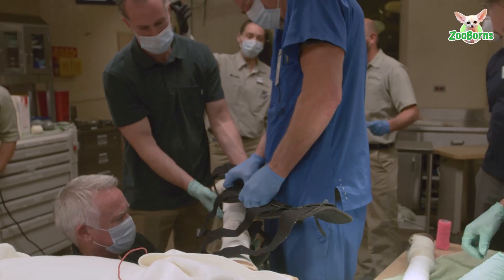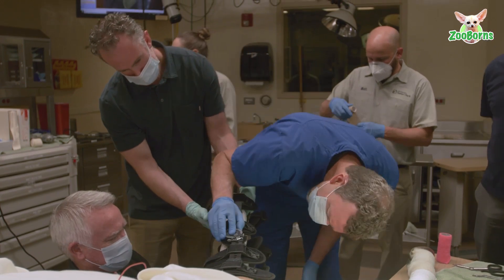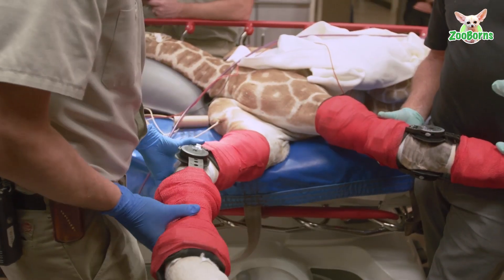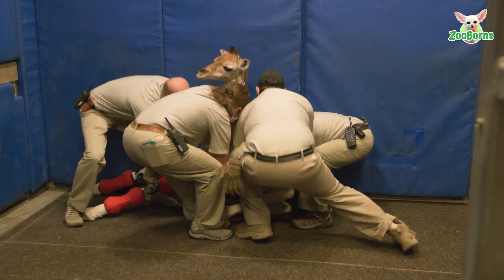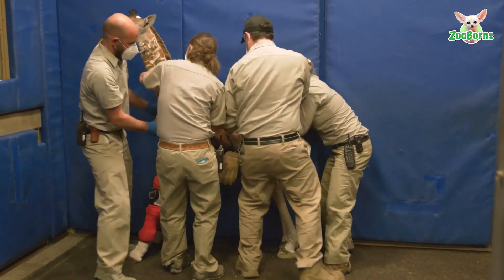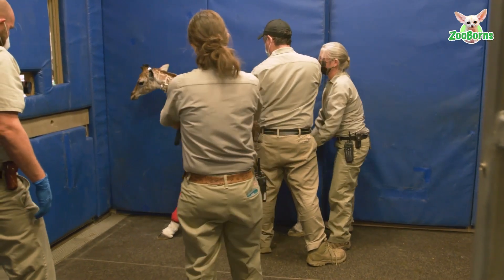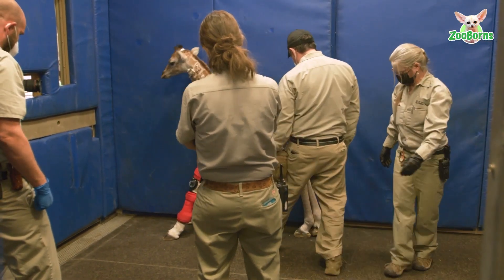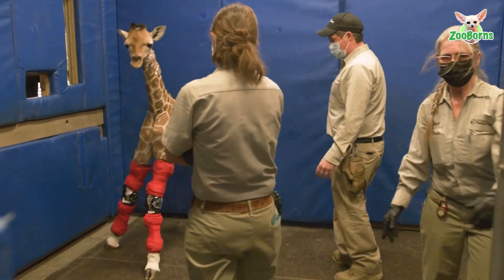Today we fit the giraffe with a custom molded brace that we had to take molds for a week ago. After we took the molds last week, we put the giraffe into some off-the-shelf braces temporarily so we could fabricate the braces and bring them in today and fit her with a definitive product. It is a custom molded carbon graphite brace, and we put the giraffe pattern on there too, just so it would blend in with other wildlife.